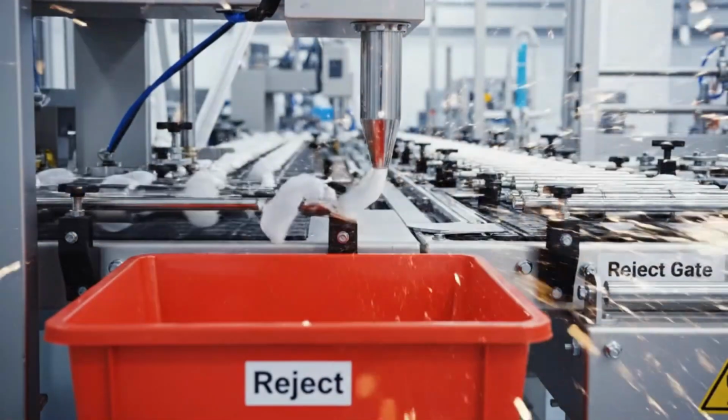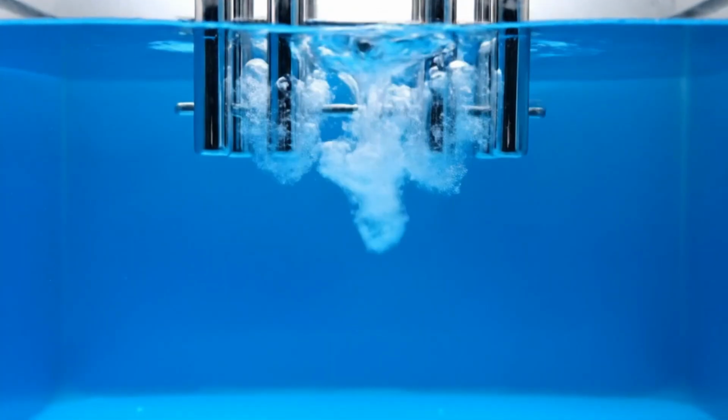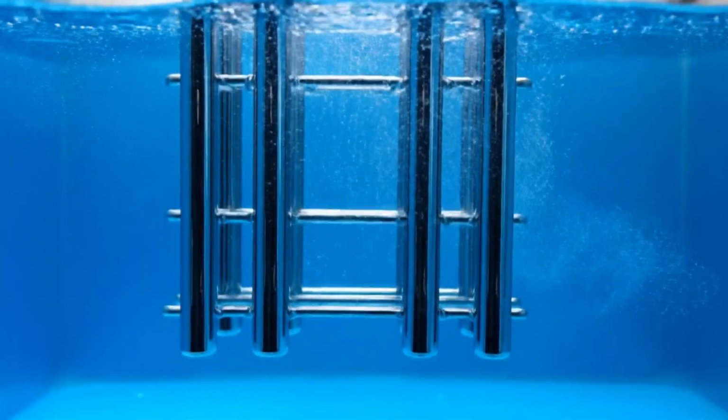One strike, and you're out. There are no second chances for a failed safety barrier. Double testing ensures that our condoms are the safest in the world, meeting medical-grade standards.